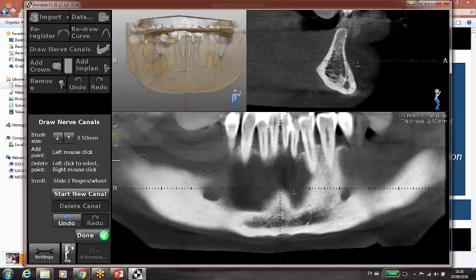Wait a second, Luca. We are trying to do the same thing also on our computer. Excellent. So it's a little slow now. I don't know why. We got into this 3D image, but we cannot get out. You can hit the 3D image here. There's an icon there that you can hit.